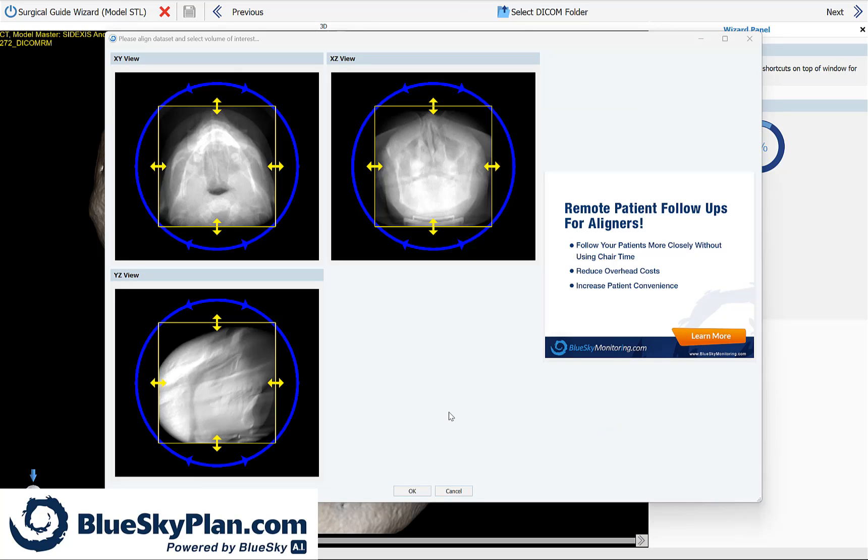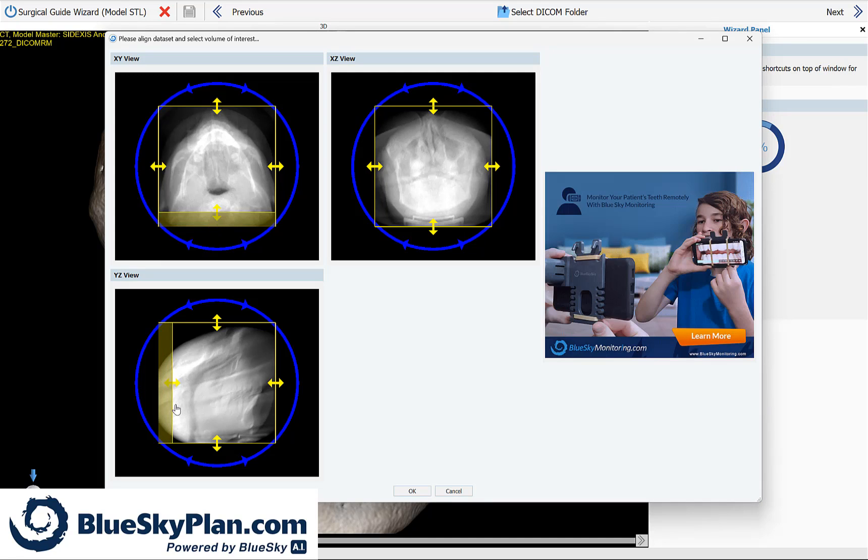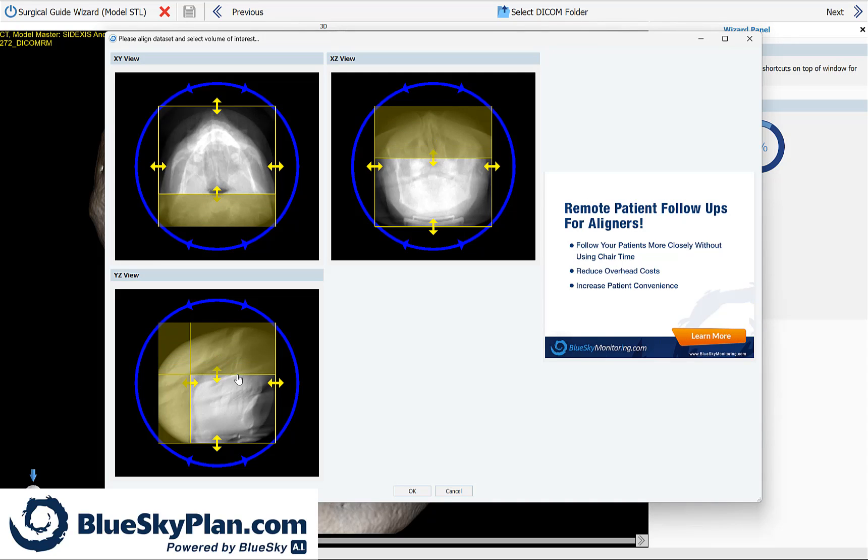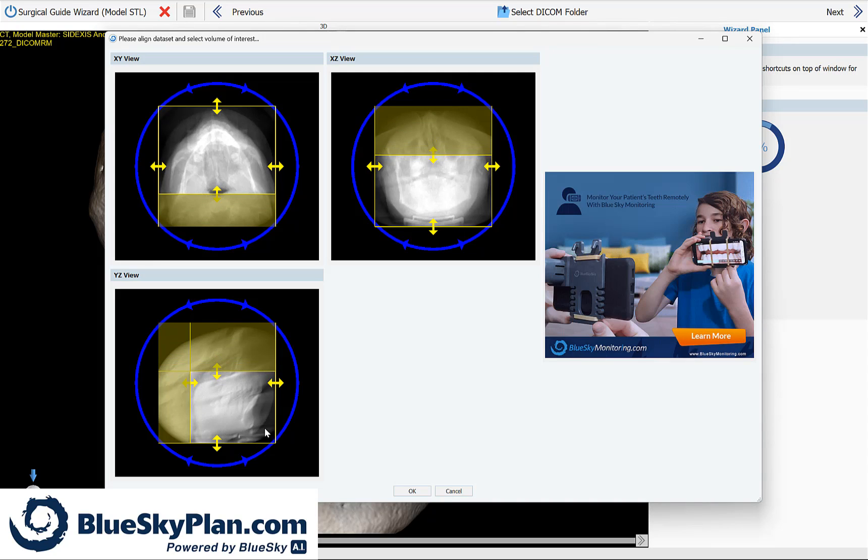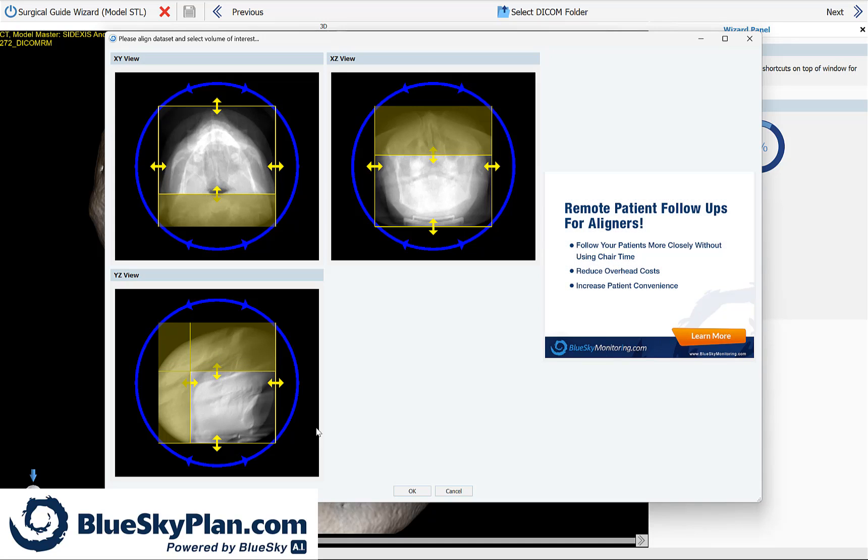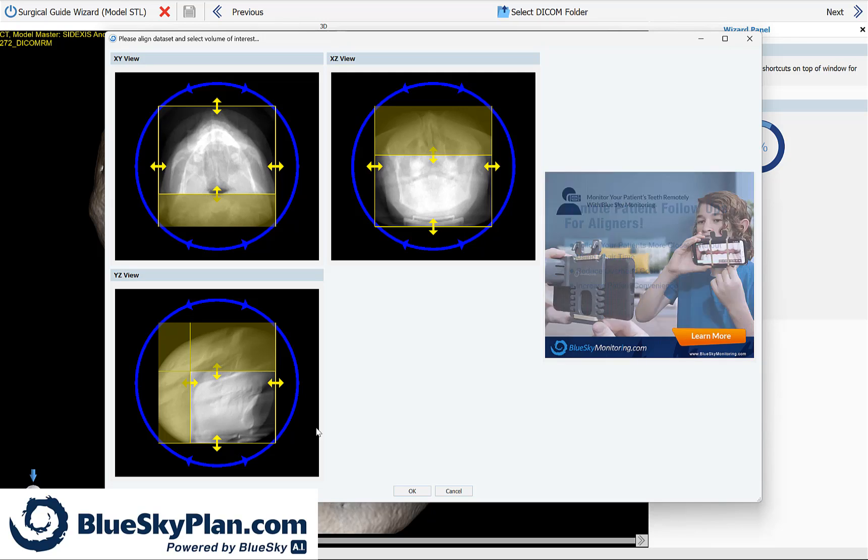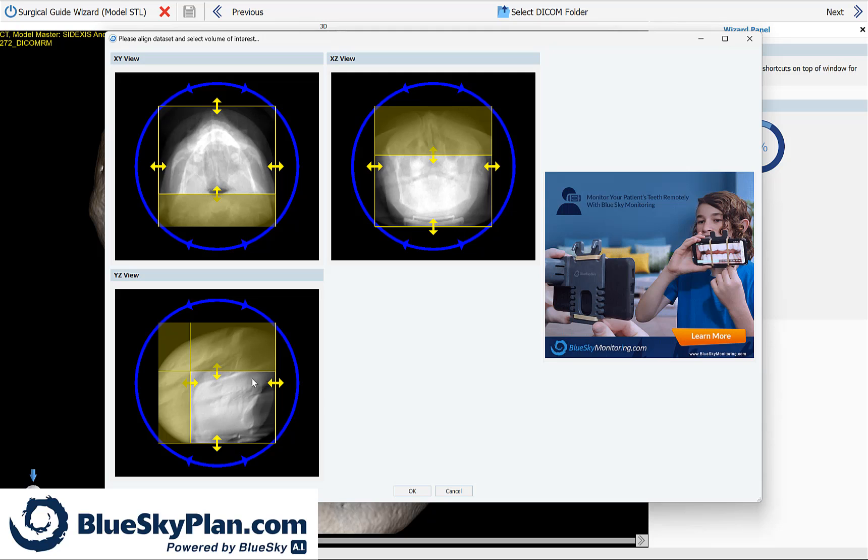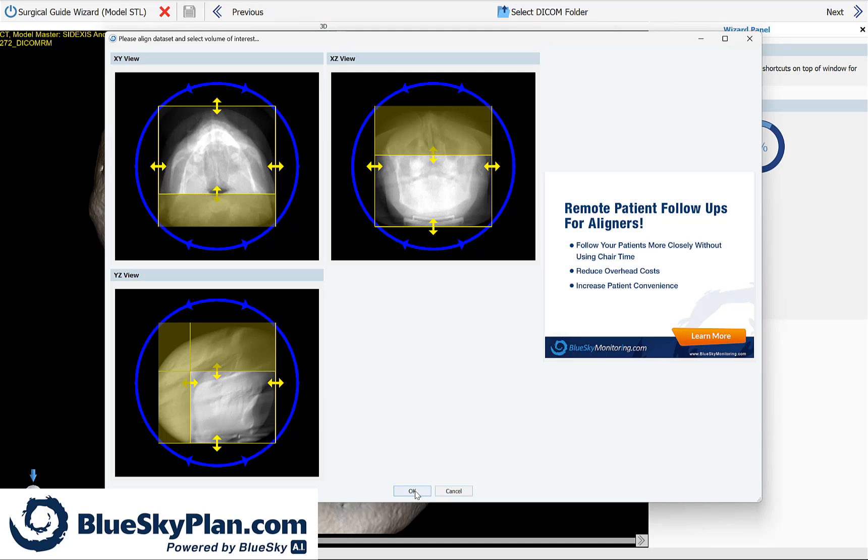The software now prompts you to define the relevant field of view. Simply use your left mouse button to grab and drag any of the yellow borders and drag them inwards. By defining the relevant field of view, you will see that relevant section much larger in the software and it will reduce the processing power and amount of resources necessary for your computer to proceed with the implant planning. Once you've defined the relevant field of view, select OK.